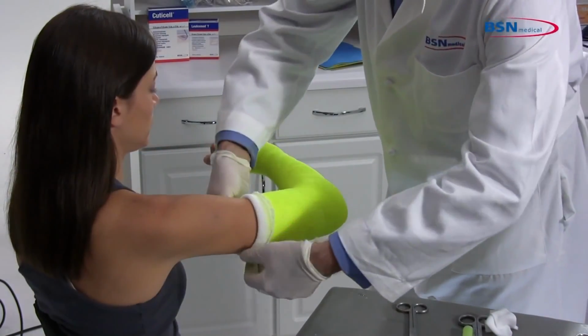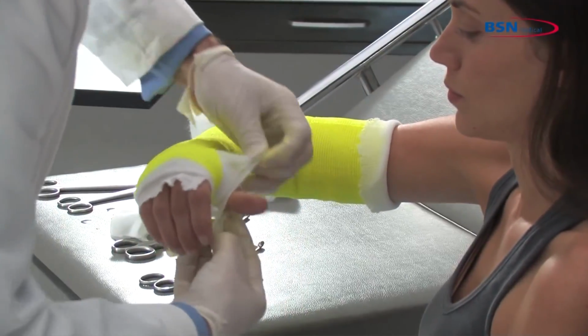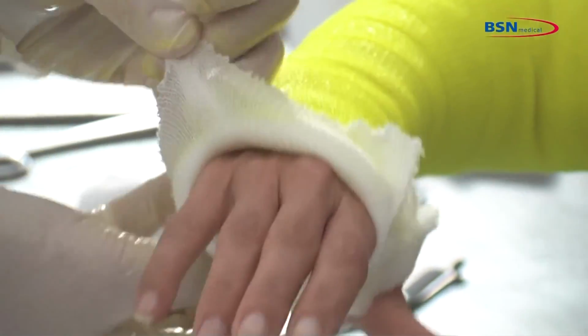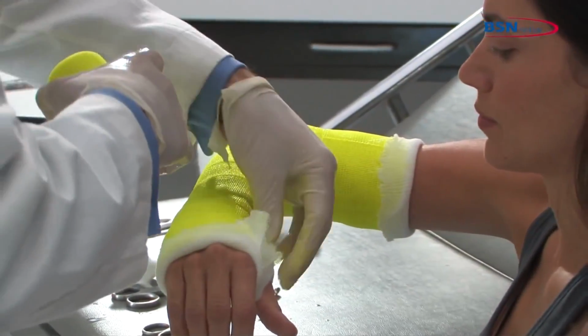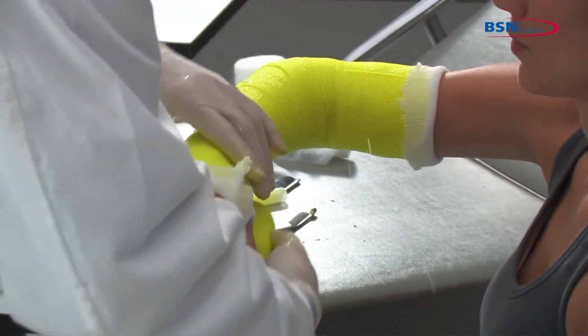Fold back the stockinette at proximal end, thumb, and distal side for protection of the skin and creating a soft end. Take a second roll and dip 2-inch or 3-inch cast tape in water, squeezing 1 to 3 times. Remove from water and squeeze 1 time to remove excess water.